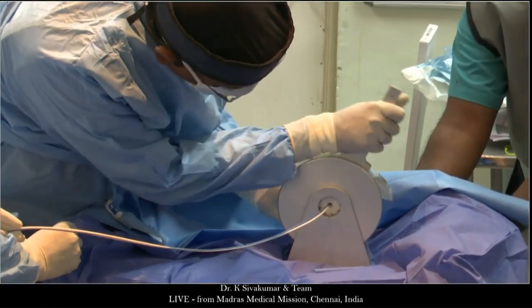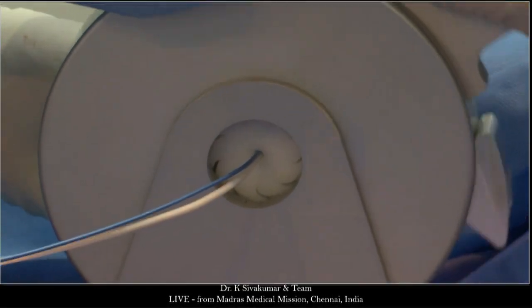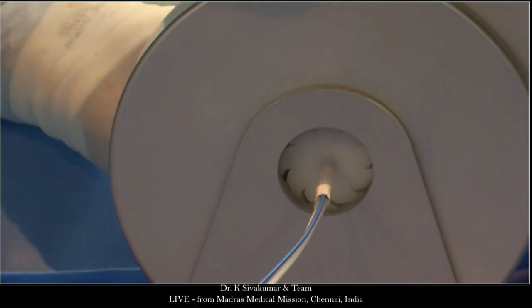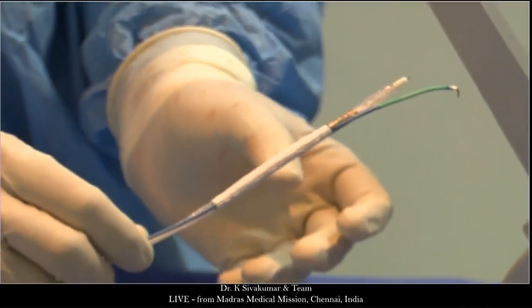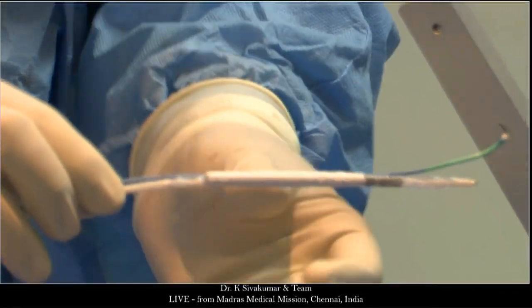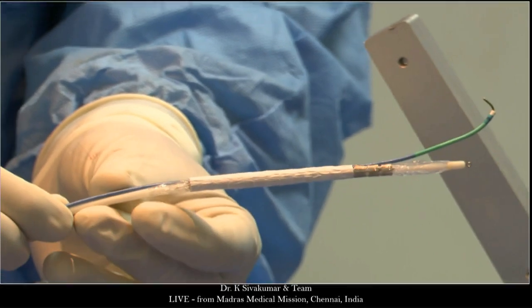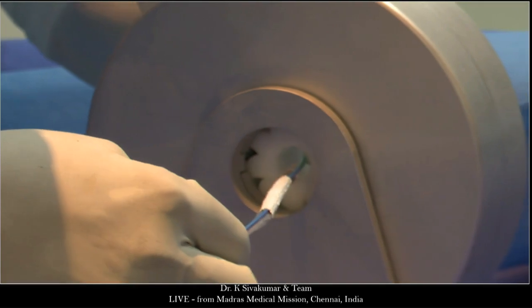I'm standing on the opposite side in order to show you the video. And in the groin, you have a dry seal sheath? I have a 24 French Cook sheath. I will show you before I tighten the crimping further. Can you get it focused? So here, I'm using a double wire, one catheter plus one balloon, single stent strategy. Z, can you see the picture? Yes, very clear. Very nice. So I'm going to use further crimping in order to get it into a much lower profile.